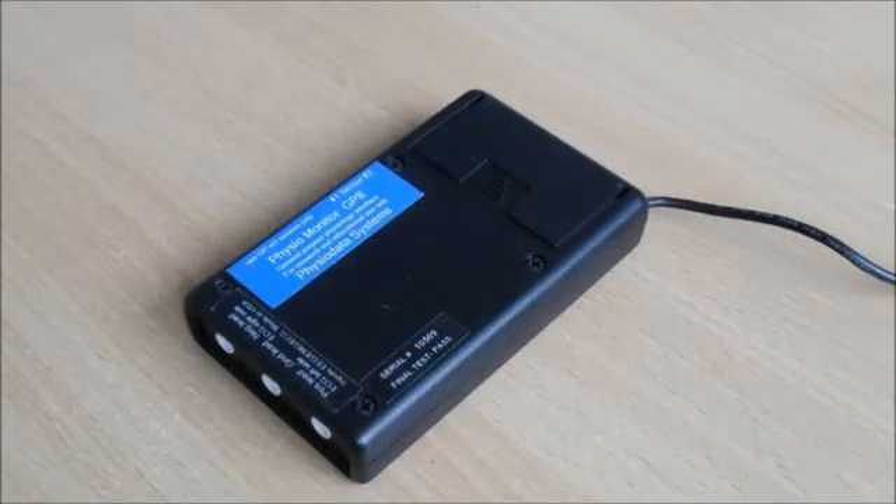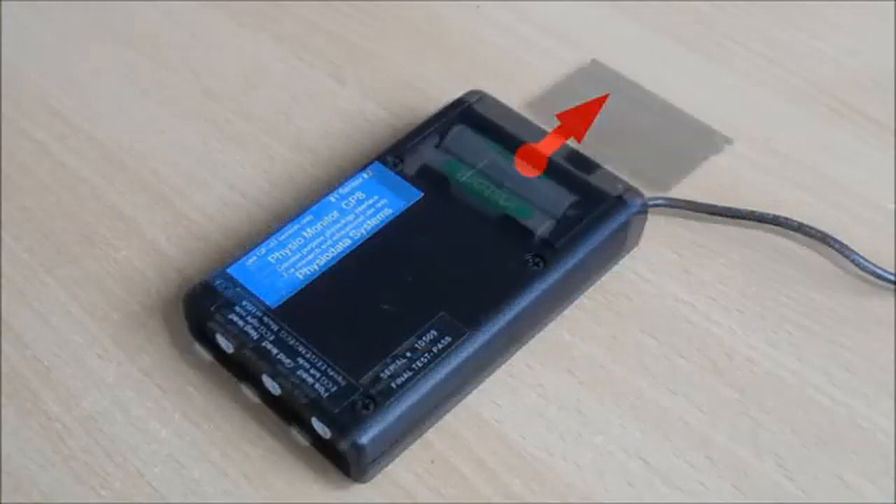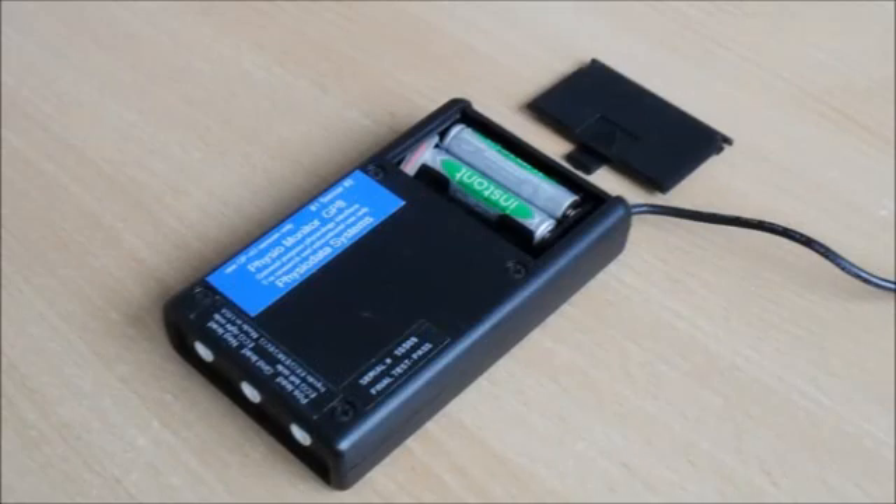The battery compartment is in the bottom of the GP8 — the cover slides off. If you need to replace batteries, please be careful to insert them the right way or you risk damaging the device.